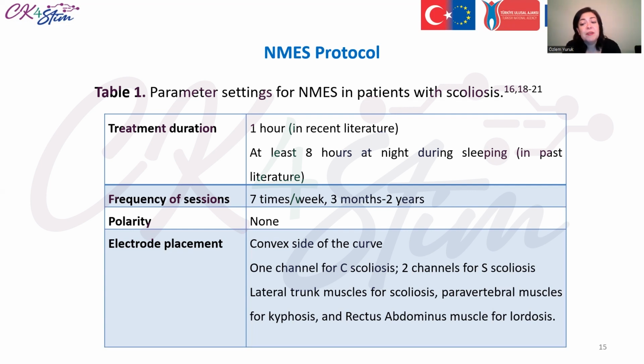The electrodes are placed symmetrically to the apex of the curve, avoiding stimulation toward the concavity of the compensatory curves and undesirable stimulation of the shoulder girdle. The distance between the electrodes depends on the curve and trunk size. The electrodes must remain within the boundaries of the curvature.